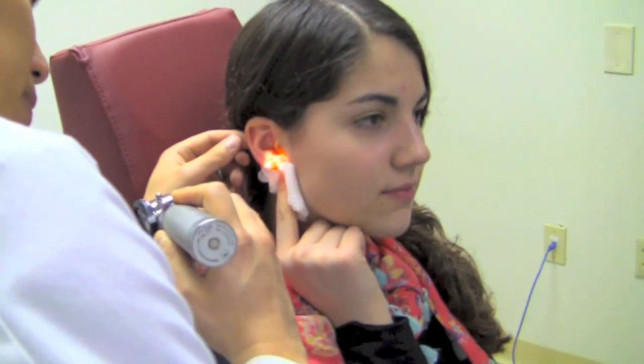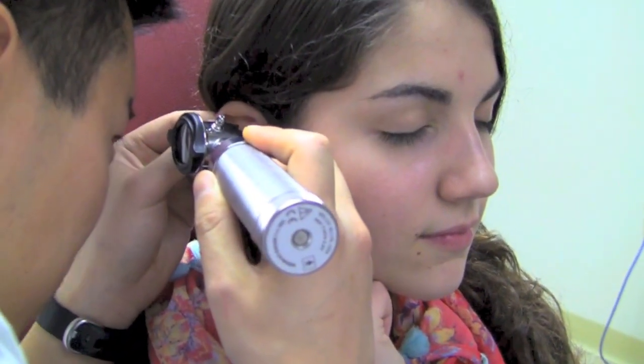With an infection, it is not unusual to obtain a culture in order to determine what germ is present as well as what antibiotic will work best to get rid of it. Regardless of how and where the culture is obtained, the same basic steps are followed.